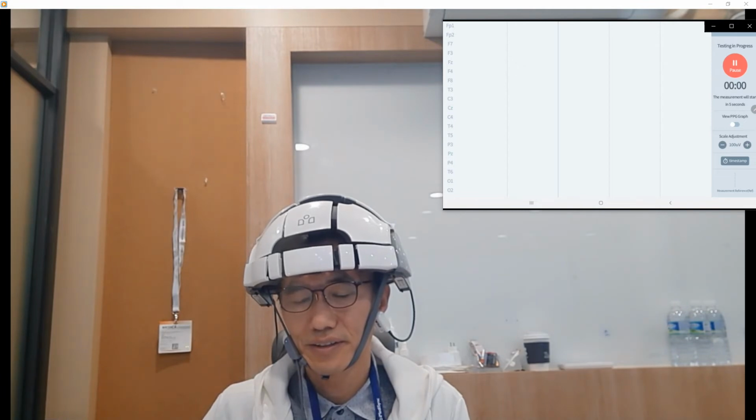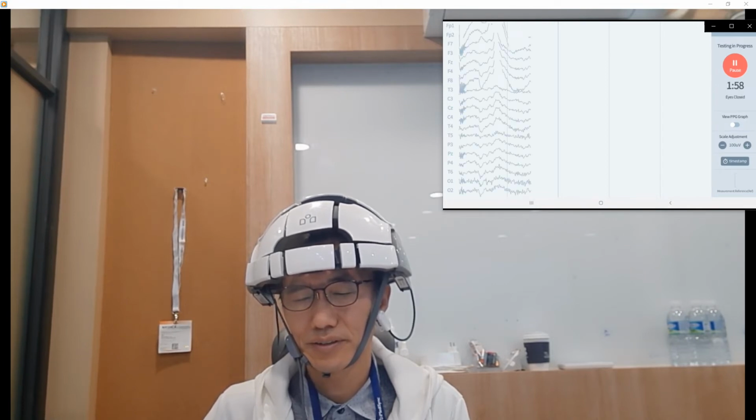And now I close my eyes. You can review the eyes closed signal quality.